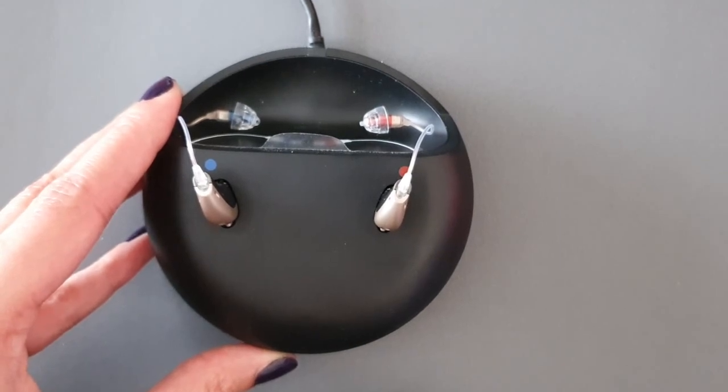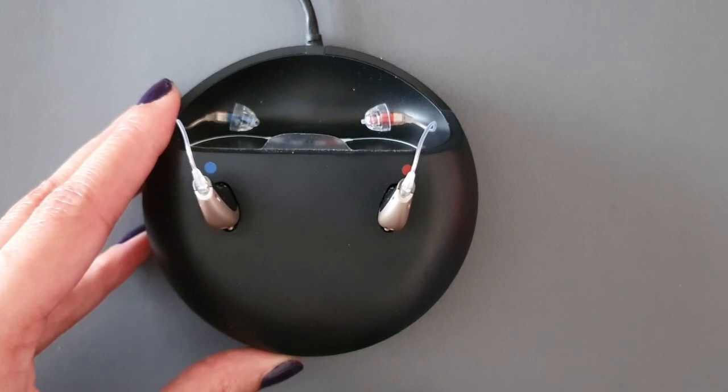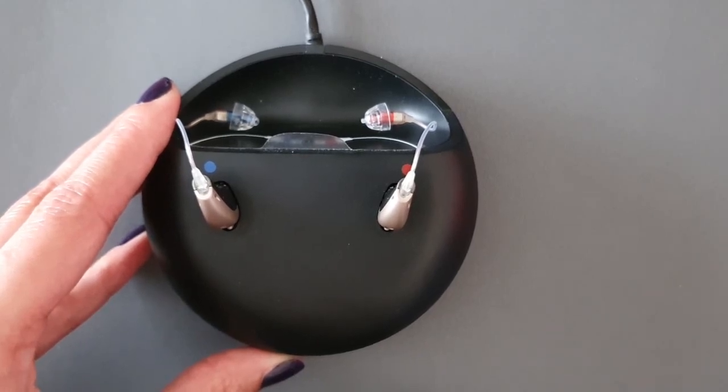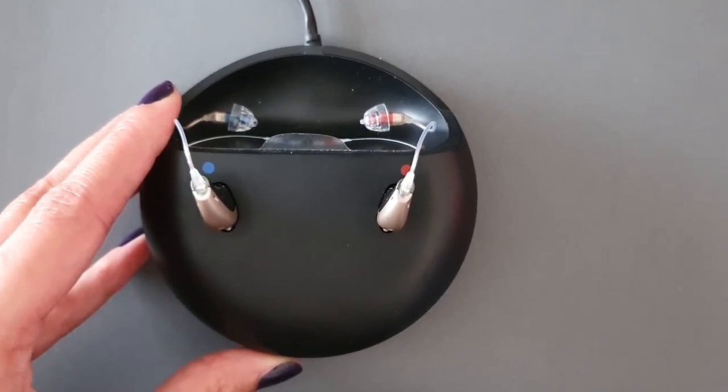You're always advised to leave the charger connected to a power supply when the hearing aid is seated in the charging port. It's important to charge your hearing aids every night to ensure a full day's worth of battery life. Charging time varies depending on remaining capacity: three hours for a full charge, around one hour for fifty percent, and around half an hour for twenty-five percent charge.